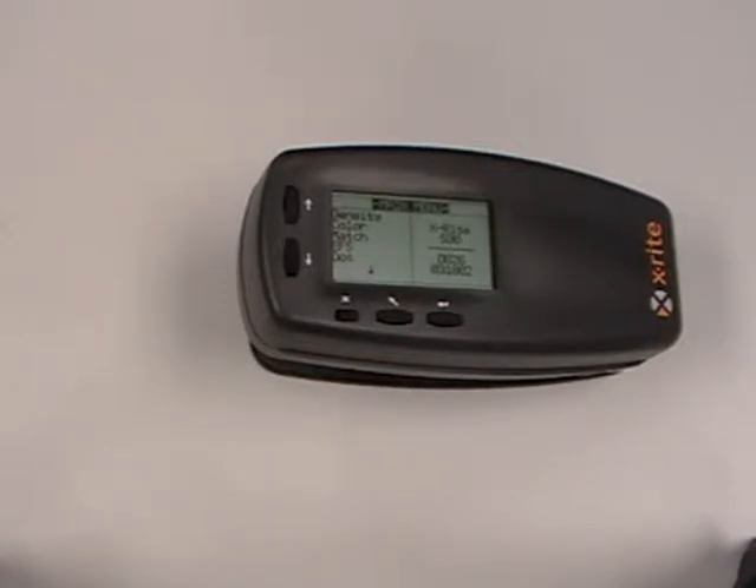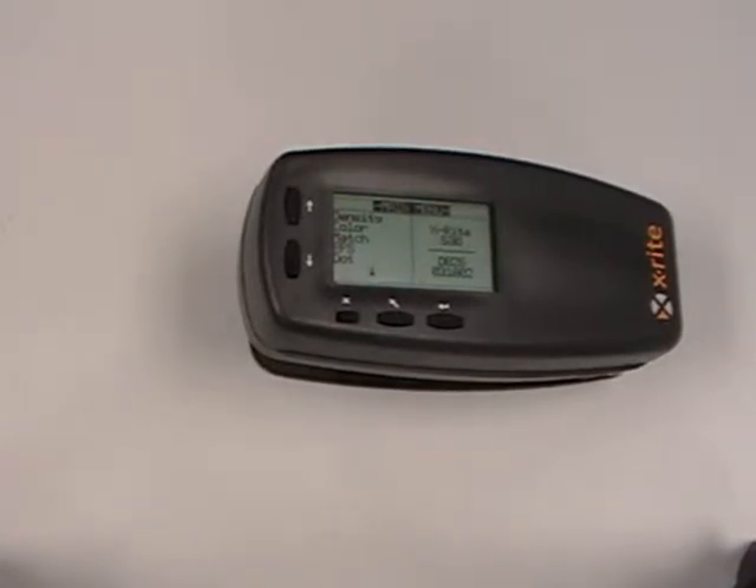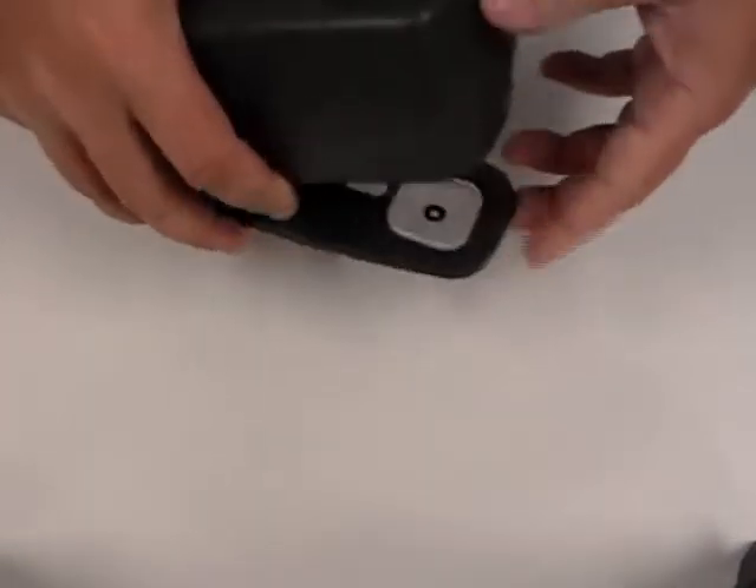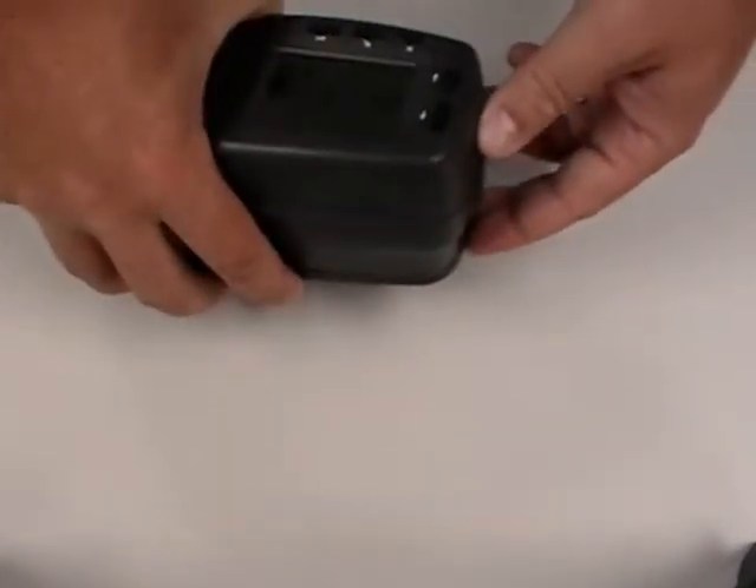This error can happen for a couple of reasons. One of the first things we can do to check what is causing this error is by checking the lamps. To do so, you can take the instrument and actually raise it a few inches above a desk and just take a base measurement.